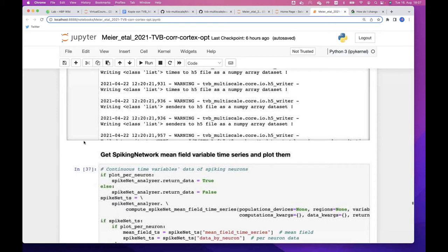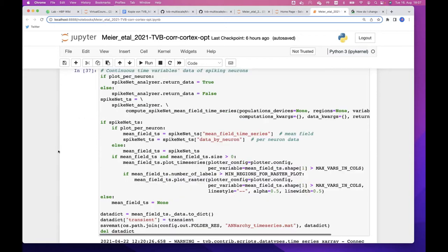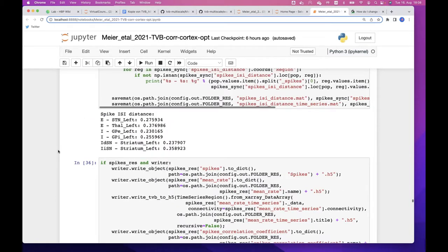It's just if you want to change it, you would uncomment. And now we simulate. And you can see the compilation is quite fast. Then there's a lot of printout for you to be able to check if everything went well in the setting.